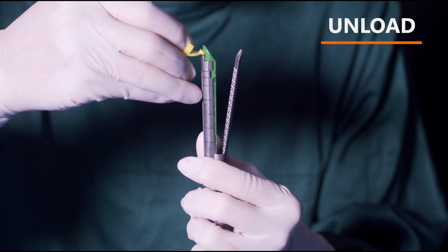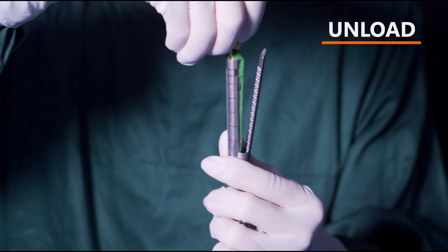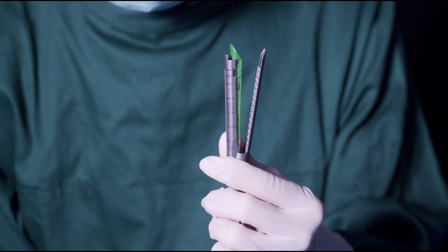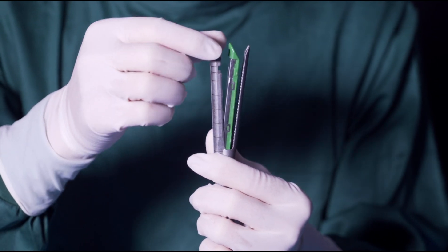Insert the forceps or pointed tool into the gap between the reload and the cartridge and pry the reload until it is separated from the stapler.